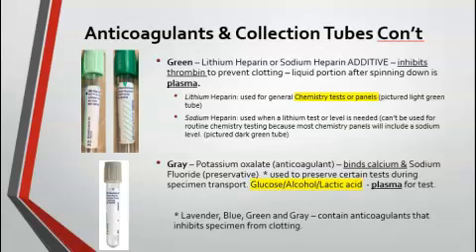For the sodium heparin, it is also used in chemistry testing, but again, you couldn't use the sodium heparin tube if sodium was a test that was ordered, because the sodium in the sodium heparin tube would throw off the test or the result for the sodium, just like in the case of the lithium. So as a lab tech, you just have to be careful and know what additives are in what tubes so some of your additives don't interfere with testing results.